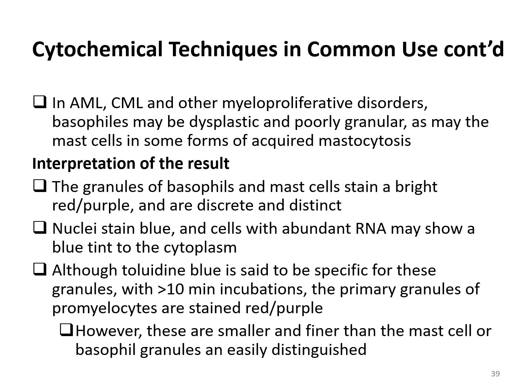In order to avoid that problem, we have to make sure that we limit the incubation period to less than 10 minutes. The only differentiating characteristic is that the granules of the promyelocytes are usually smaller and finer. As we know, mast cells and basophils have large granules.